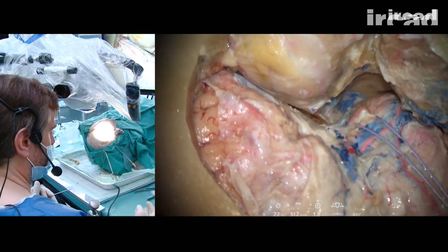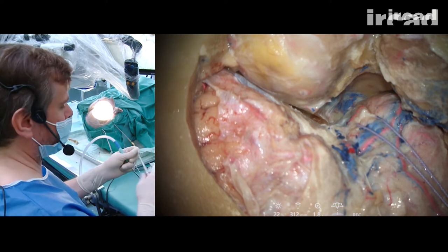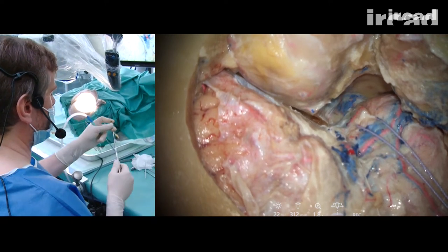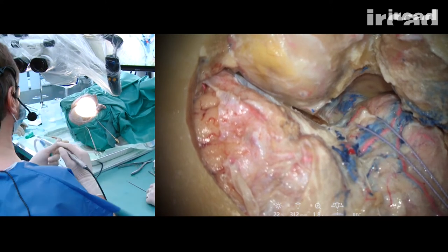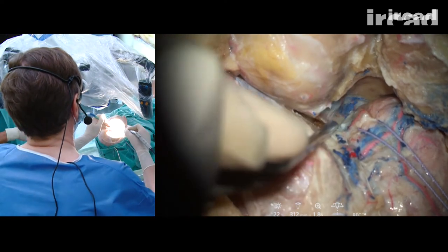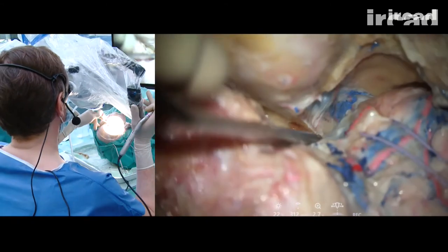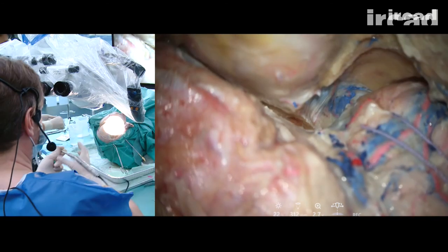So now that my structures are exposed and the base of the clinoid is big enough, I am moving back to the three diamond. The bigger the diamond, the safer it is. Two diamond is more dangerous and more difficult to control.